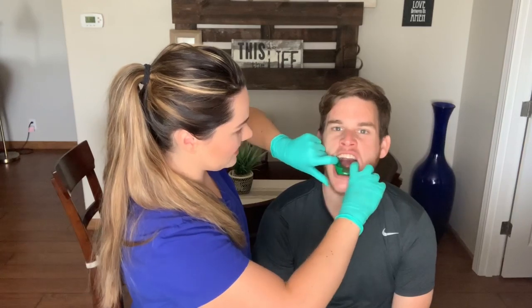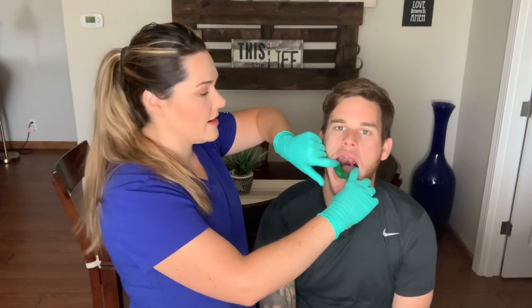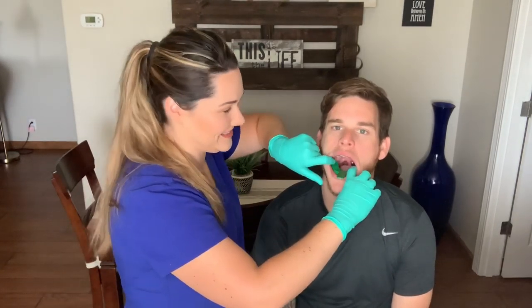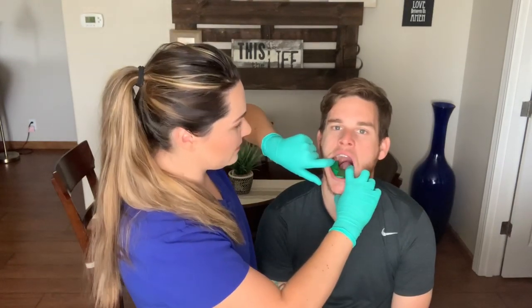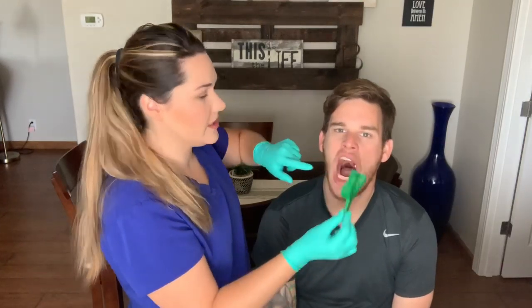Now we're going to try the bottom tray. He does have his wisdom teeth, which makes it a little more challenging, especially if somebody has a small arch with all their wisdom teeth. For the bottom, you want them to lift up their tongue. It covers all of his teeth, it's not tight, and it fits in there nicely.